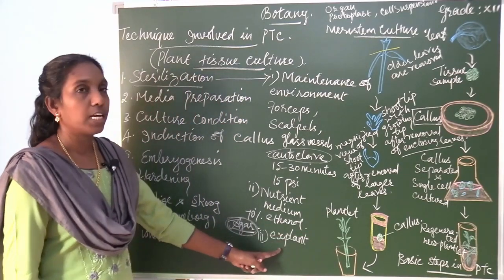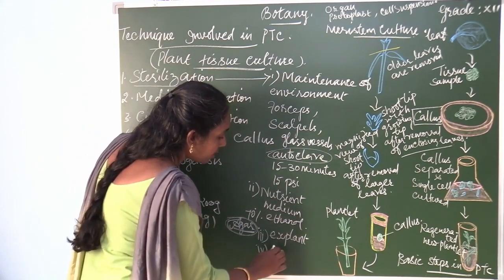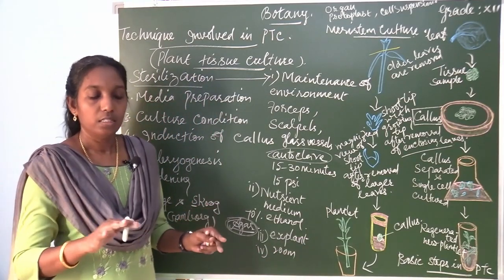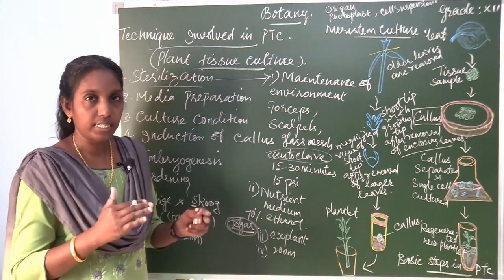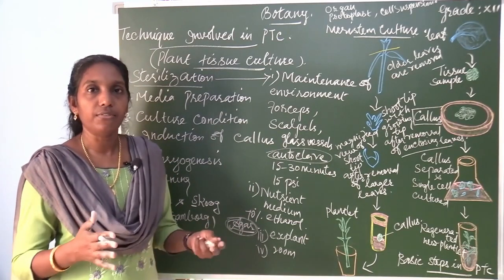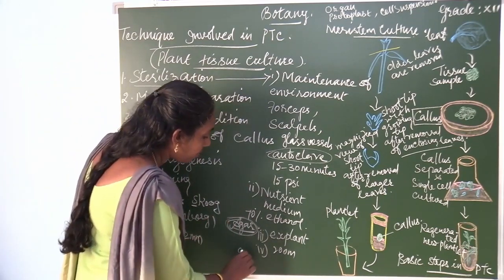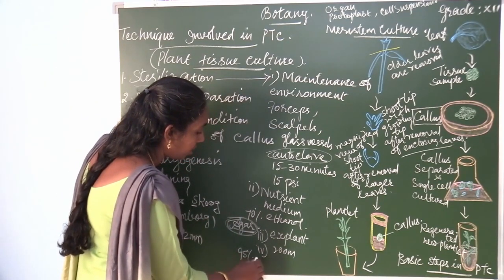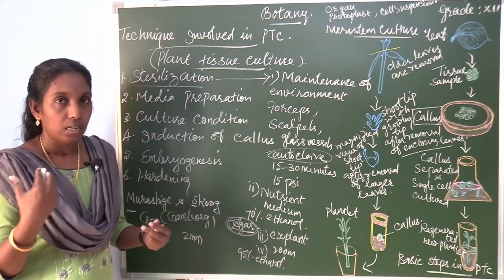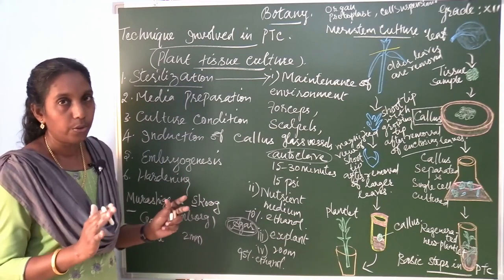Before sterilizing the explant, the room can be sterilized. Sterilization of the room: the floor and the walls can be sterilized by washing with detergents. At first, wash with detergent, and then add 95% ethanol and expose to UV radiation to sterilize the room.